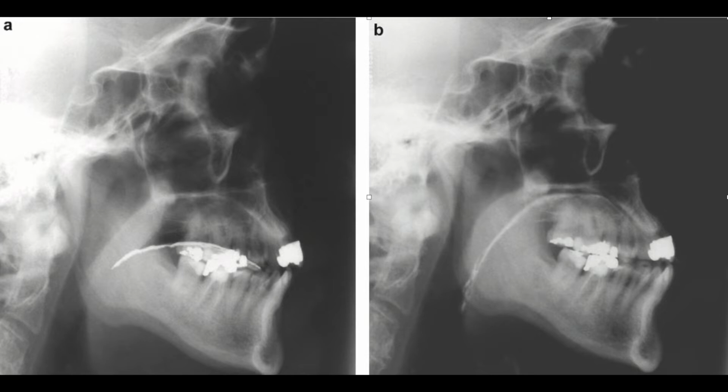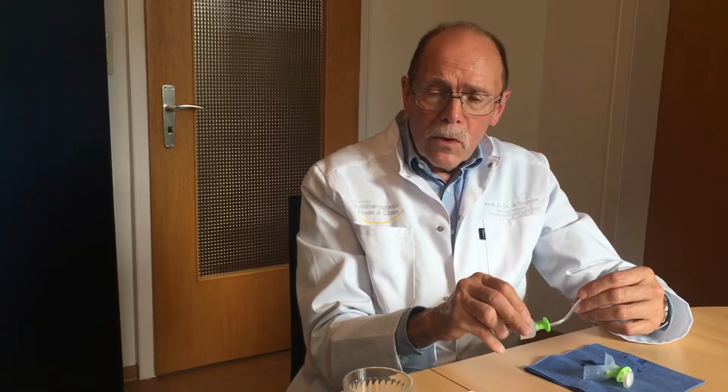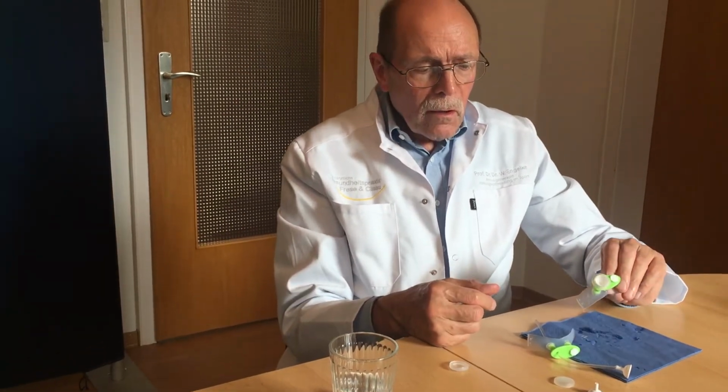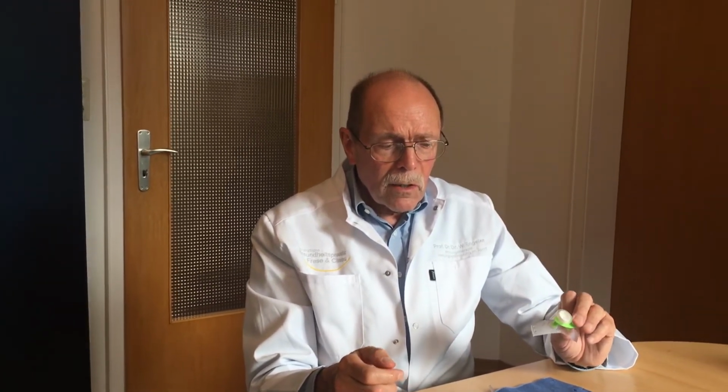We know that the degree of negative pressure inside the Donder space can be strengthened by using the second channel directly to the Donder space. Okay, I want to show now the endoscopic control of the Donder space during the activity with the vacuum activator.